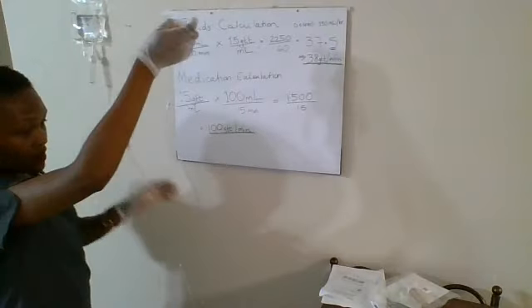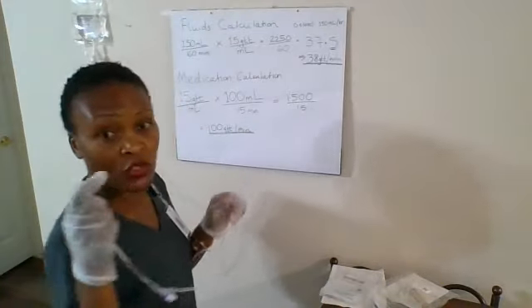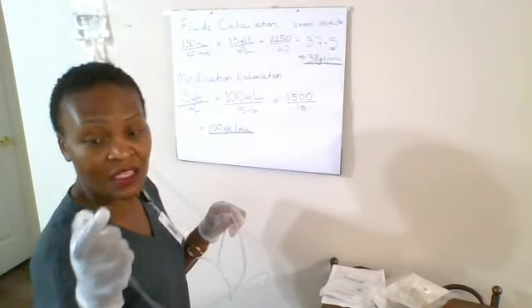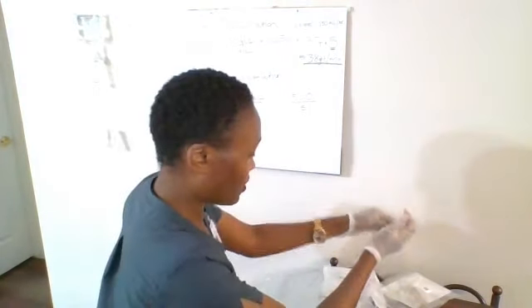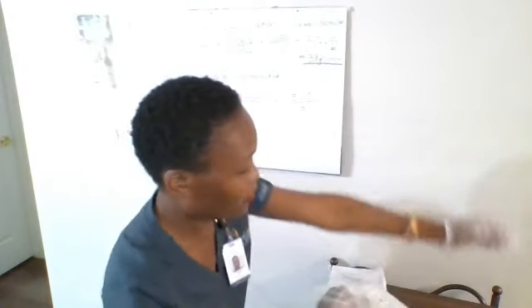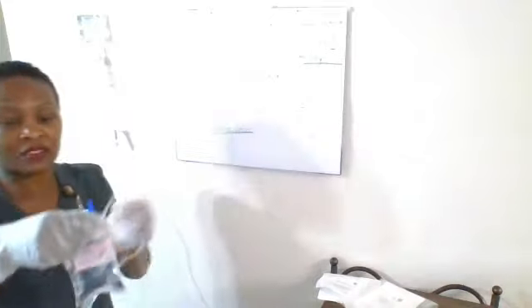and I'm going to put this aside. Making sure to keep that cap on. We don't want this touching any surfaces. Keep it on, put it back on, and take my secondary tubing here. And I will take my medication IV bag right here.